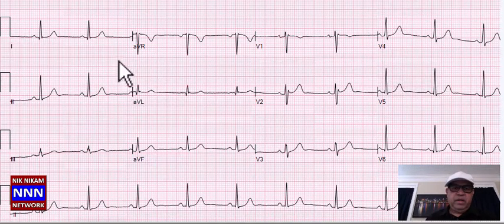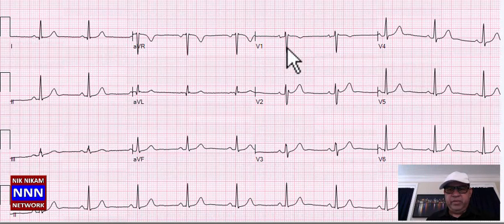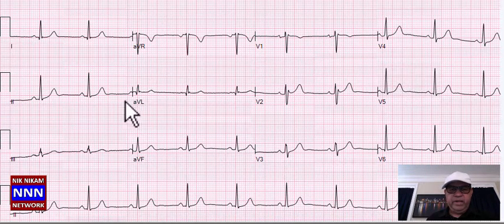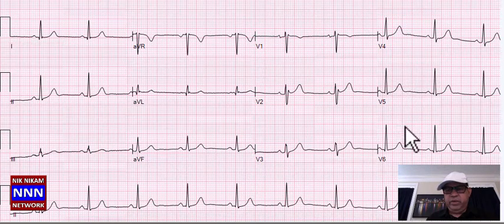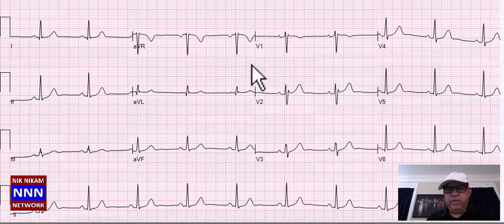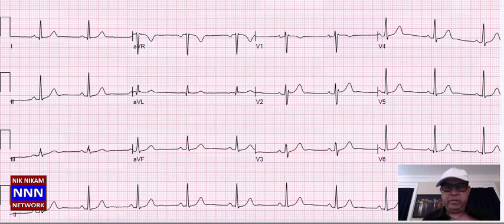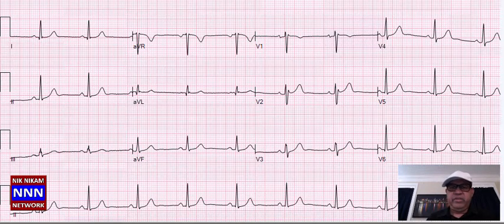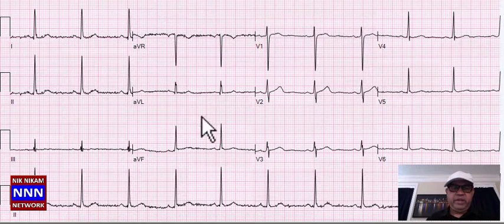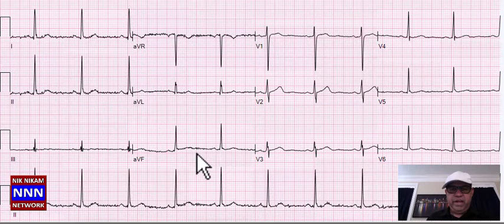Again we have a normal sinus rhythm with incomplete right bundle branch block. T-waves are upright, QRS complexes all look pretty benign. I would say normal sinus rhythm with incomplete right bundle branch block — even the computer does not read this as incomplete RBBB.